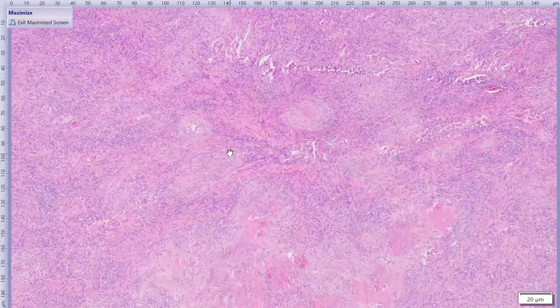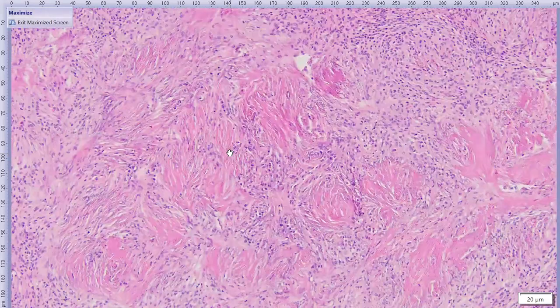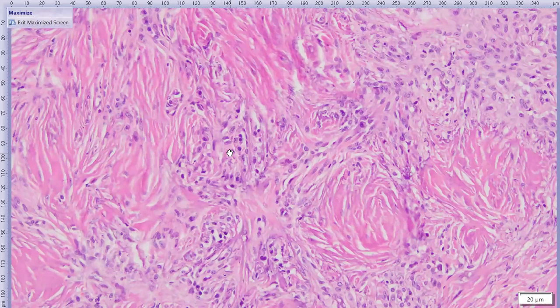So that brings up another histologic diagnosis possibility. Before I get to that, here are some regions where we have these bundles and clumps of collagen that otherwise lack cells. Collagen itself cannot undergo necrosis because it is not a living substance. It is an extracellular matrix. However, it does house fibroblasts that are the living components of the sclera. But what we have here are these regions of collagen degeneration, and there are very few living cells left in them. There's a few nuclei here and there.